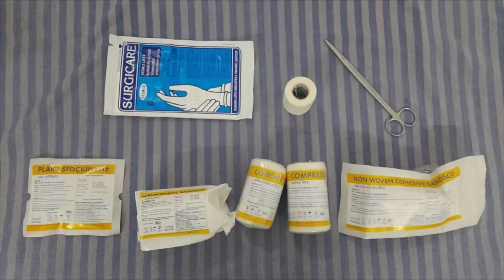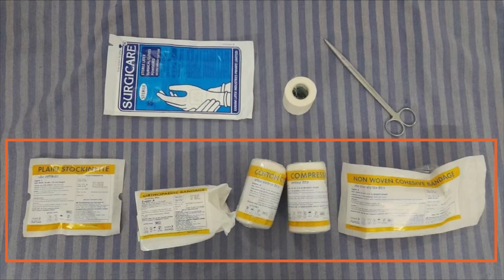Things needed include a 4 layer compression bandage system, a pair of examination gloves, and a micropore. The bandage system consists of 4 types of sterile bandage rolls and a sterile stockinette.